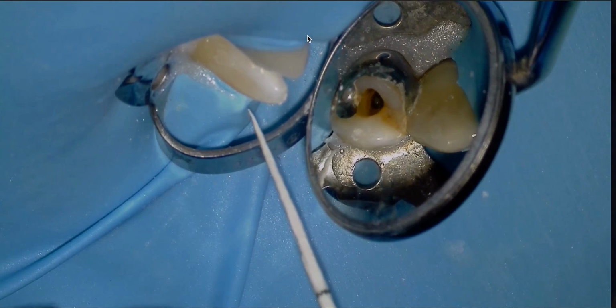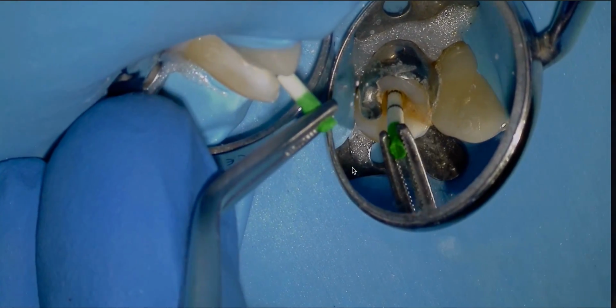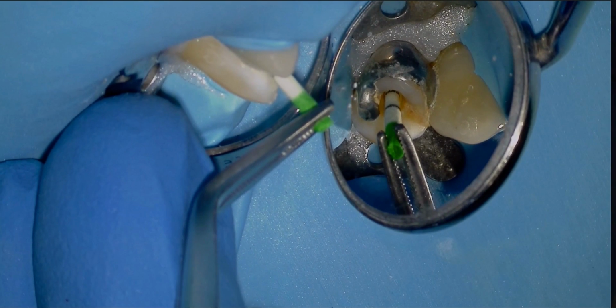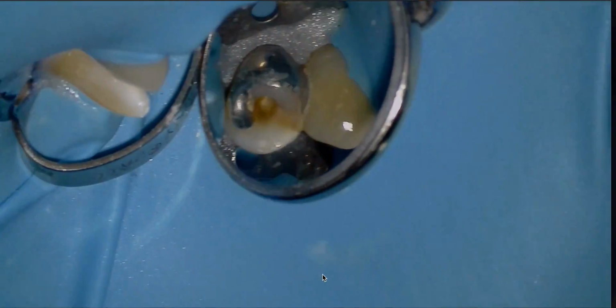It turns out this tooth only has 2 canals, palatal and buccal. So right there was a technique of checking to see if my paper point is dry or wet, and then I'm going to measure that just to make sure we're at length.